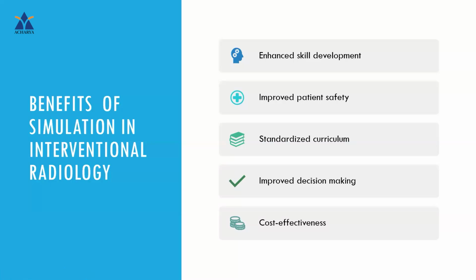These interventional procedures generally require high technical and precise motor skills. Simulation provides a safe environment to practice and refine these skills, and it allows repetitive practice of complex procedures, enhancing proficiency.